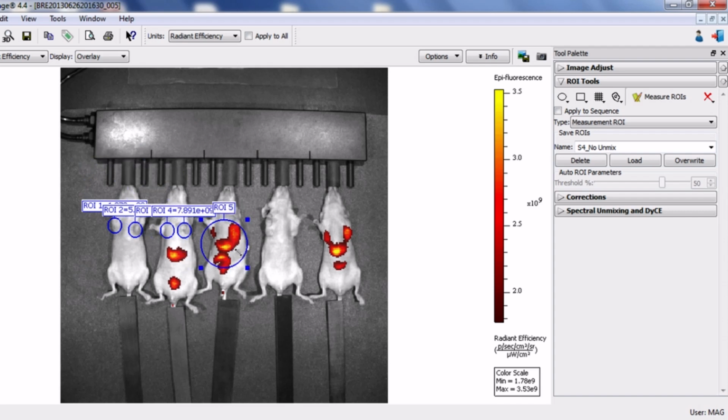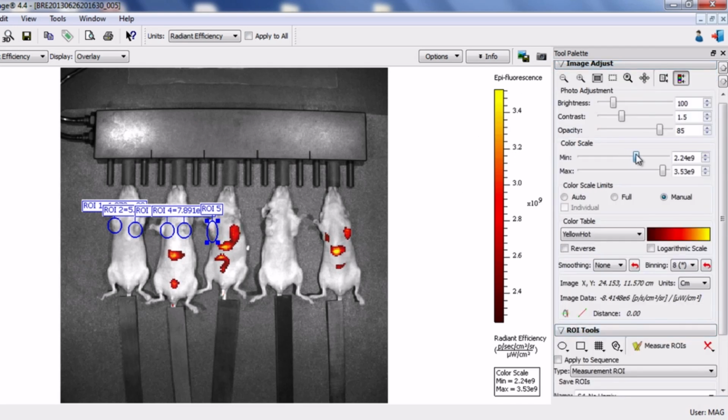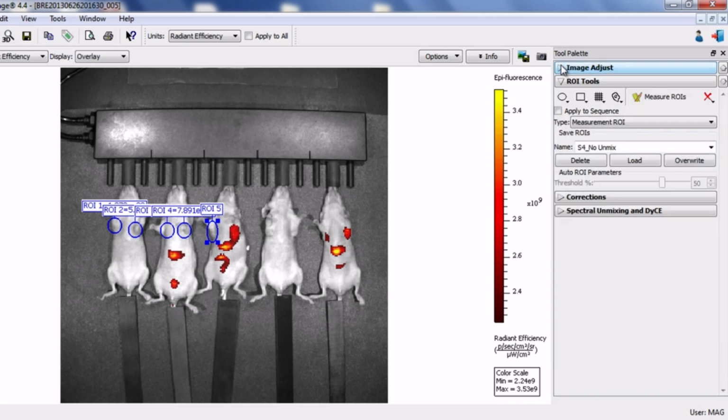Often probes can also be detectable in tissue surrounding tumor, as they are markers of inflammation. So, it is best to size ROI slightly larger than the tumor. Remember, we are monitoring the disease state as opposed to targeting tumor cells specifically.